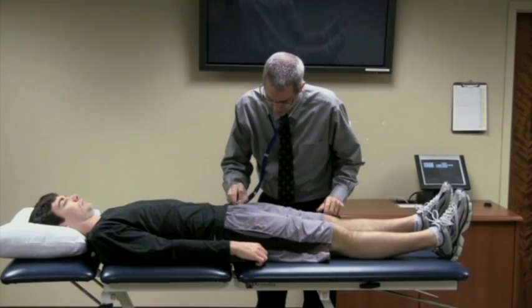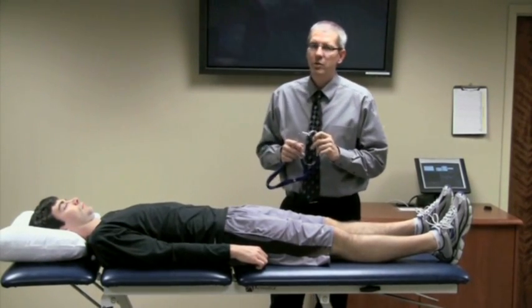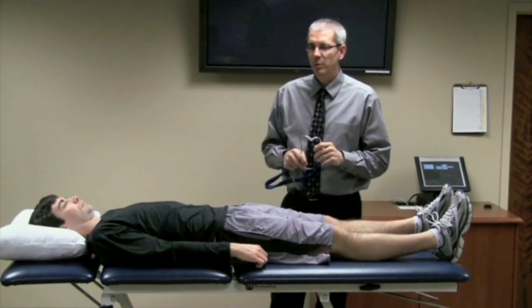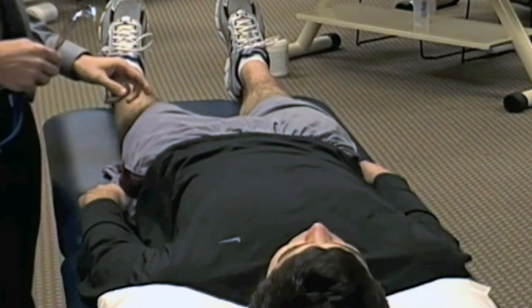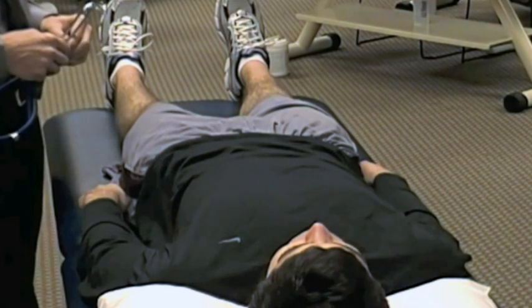Then you will tap the patella. A normal response with this test is a sharp, distinct sound. If a person has a fracture, especially a transverse fracture, the sound produced from the tapping or the tuning fork will get dissipated, so you won't have a sharp, distinct sound.